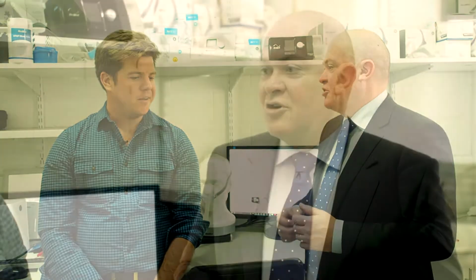But if it's mainly sleep apnea and I'm trying to get that diagnosis, then a home study will give that answer. What information do we get from a home-based sleep study? It allows us to determine how much someone's actually slept and how frequently there are troubles with breathing, either the airway partially narrowing or blocking completely. From that we can calculate how many times per hour they have trouble with breathing, and we call that the apnea-hypopnea index. We then use that to determine the severity of sleep apnea. If that's more than 30 times per hour we call that severe. If it's 15 to 30 we call it moderate, or less than 15 we'll call that mild sleep apnea.